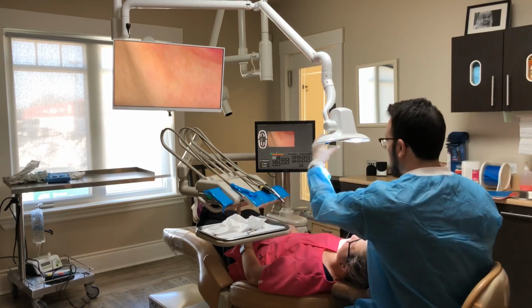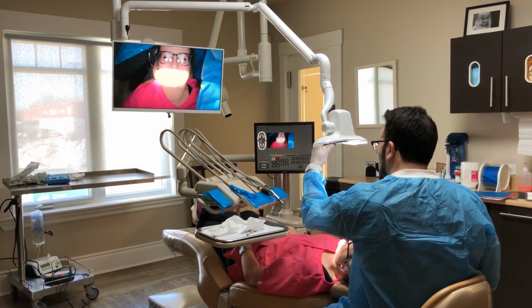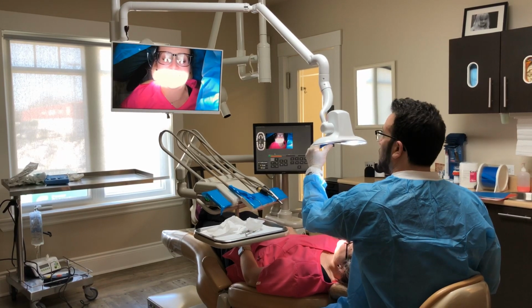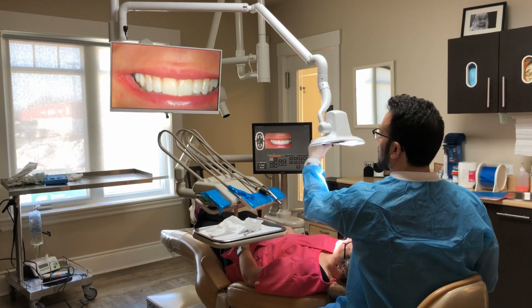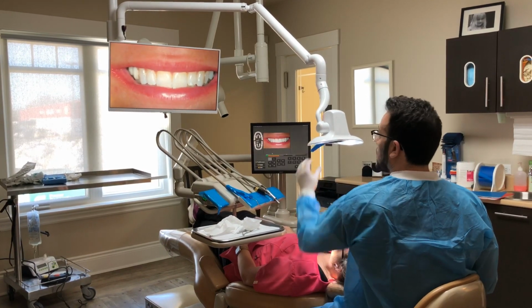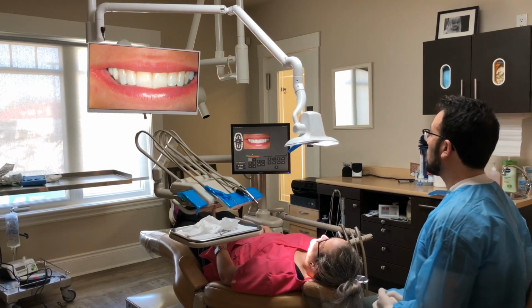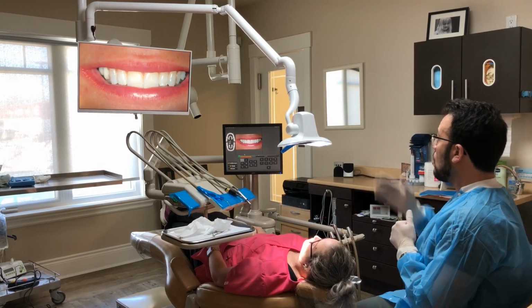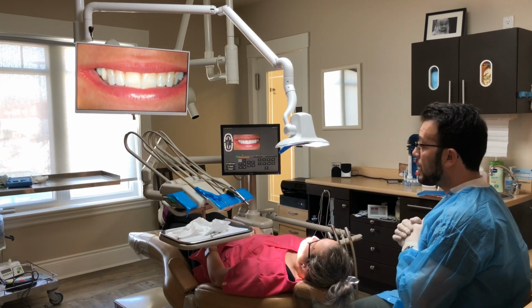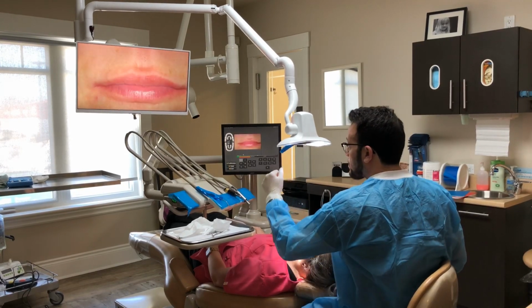Sorry. So again, let's just say I want to take a smile photo. Go. All right, I'm going to zoom in. Go ahead and smile. There you go. Instant smile photo, high quality HD photos directly on the ELIO screen or in the patient file. Very quick to document and to record all those photos.